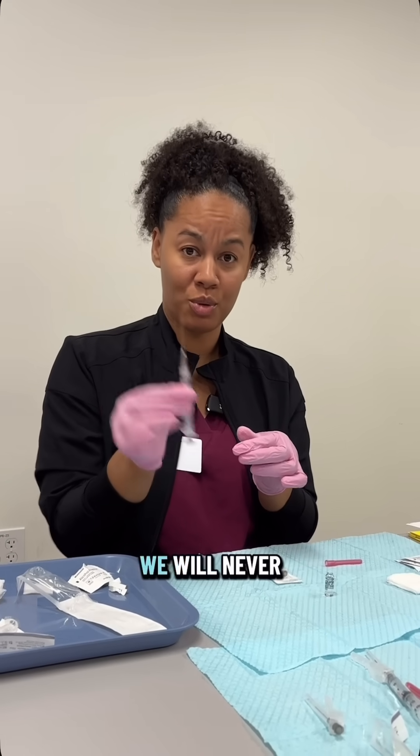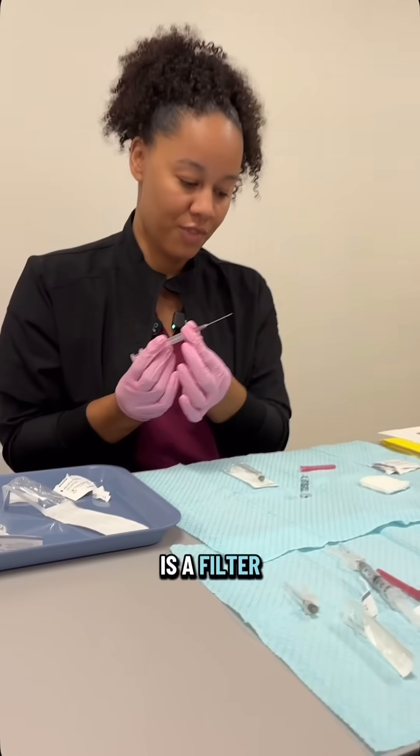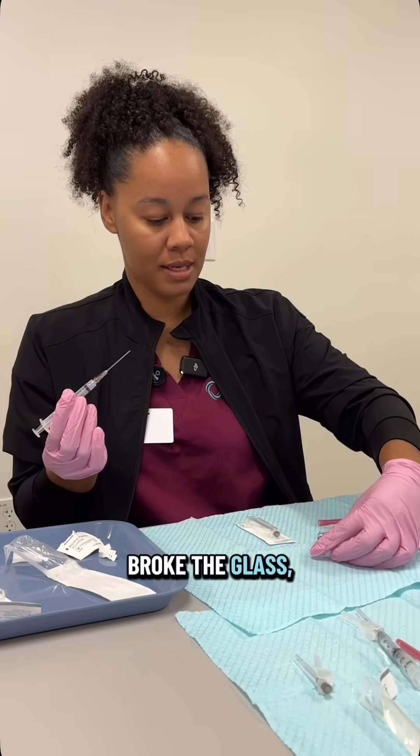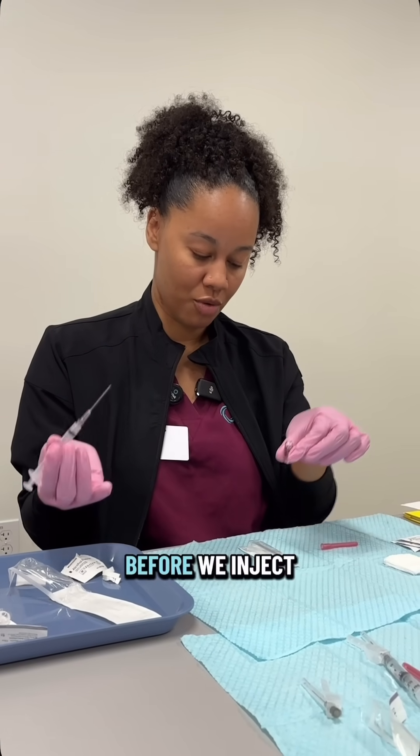This is a very big needle — we'll never inject anybody with this. But this is a filter needle, because since we broke the glass, I want to make sure that we don't get any glass shards into the syringe before we inject someone.